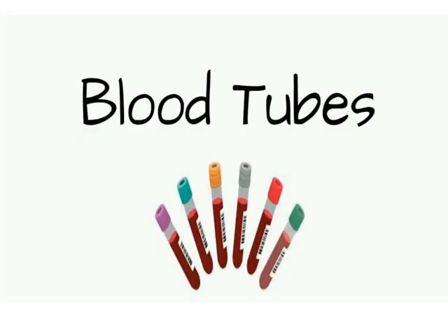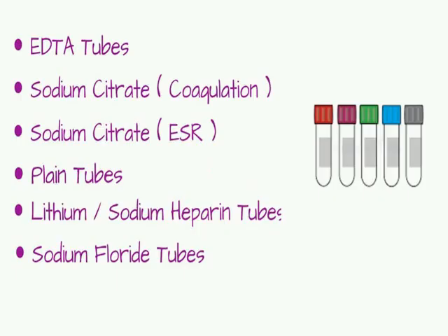Today we are talking about blood tubes because it's very important to choose the suitable container or tube for the required test, because choosing the wrong tube will affect your results. Here are some of the blood tubes that we usually use in labs.